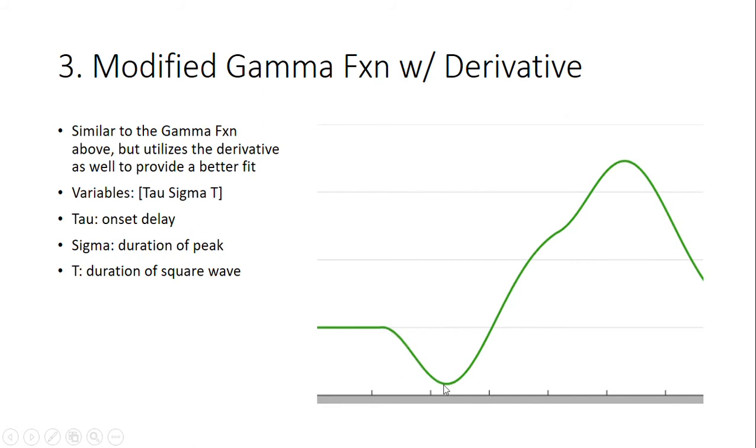You do notice that there's the initial downshoot, which would be typically seen. It may be slightly severe in this case, but you can figure out based on whatever data you have, your expected values for that to be, you can adjust and best fit your group.